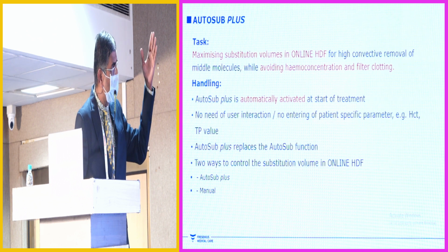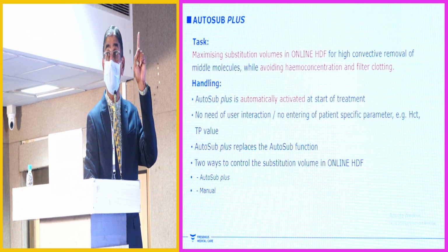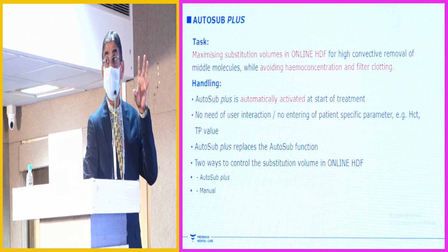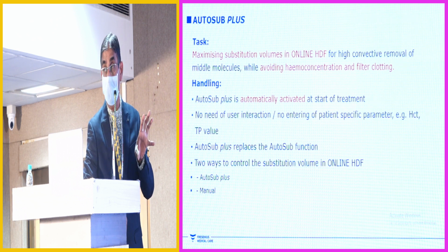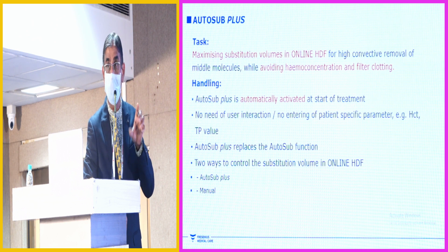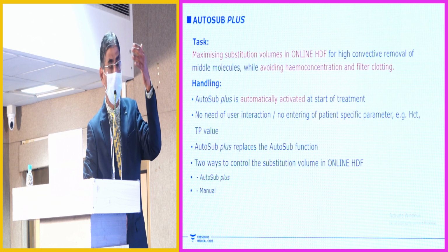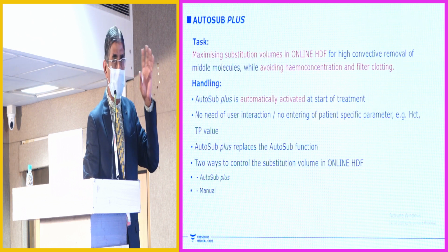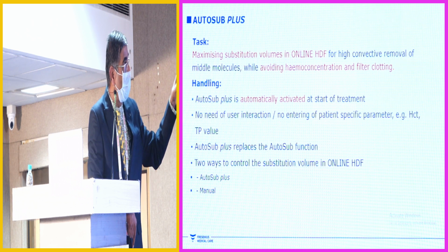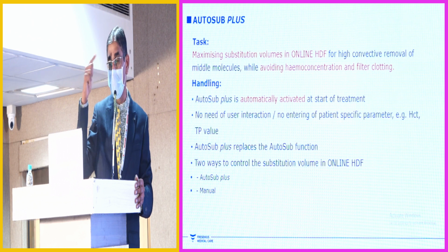So what I'm trying to tell you is, this is automatically calculated based on the effective blood flow rate. That is the reason most of the time the substitution pump will stop, twice, probably 3 times it will stop the pump, and the third time it will become HD. You can see, the healthcare provider would have programmed HDF, but it will automatically change to HD because the auto substitution will be calculating based on the effective blood flow rate.